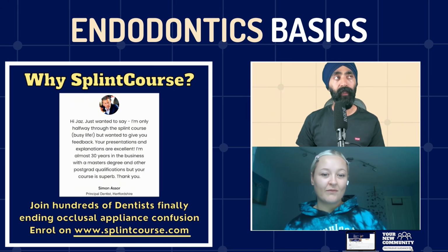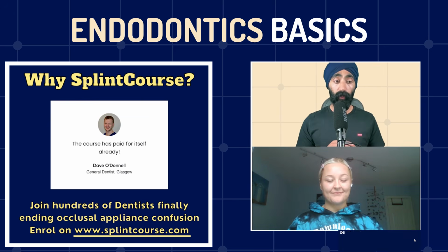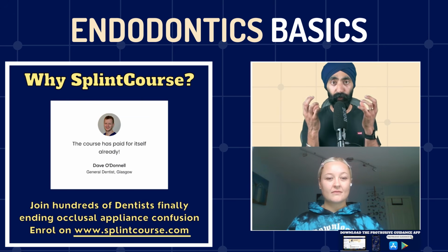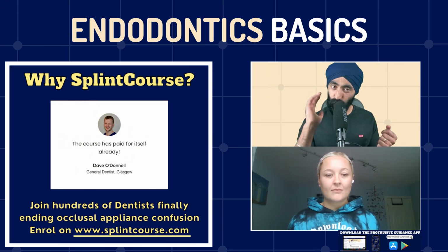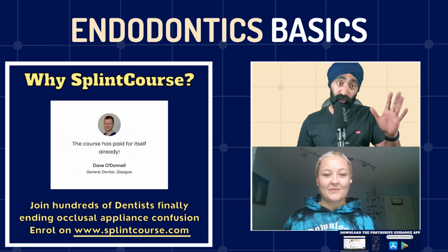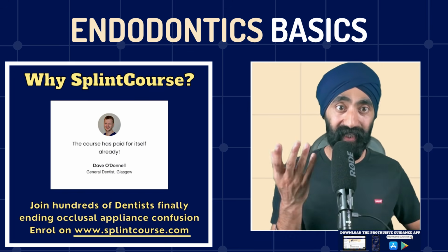Because classically, when I was at your stage and a young dentist, we have this perception that it should look sexy on the radiograph. Yeah. So at your stage, I was looking at the radiograph, right? The thrill of the fill. Okay, you put your GP in and it looks as though it's to length and it doesn't have any voids in it, and we think, wow, this is success, right?